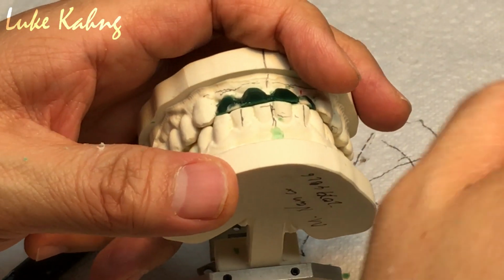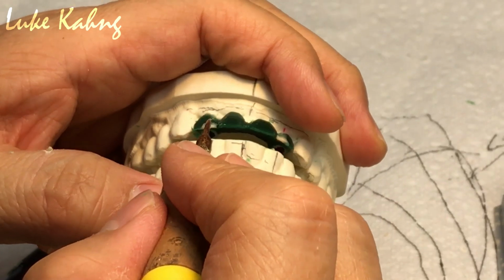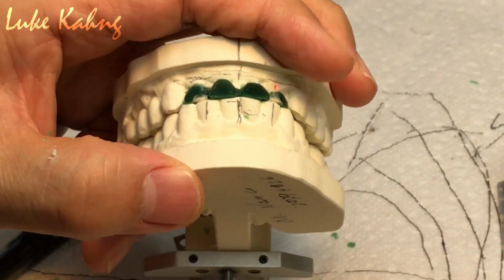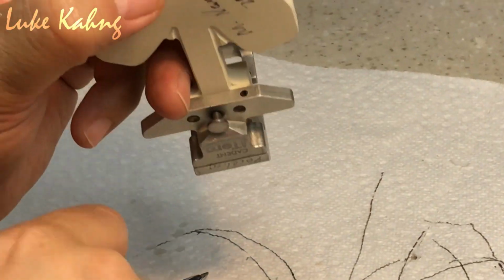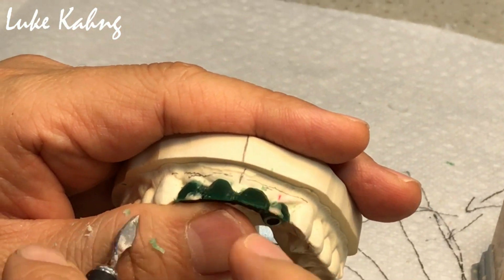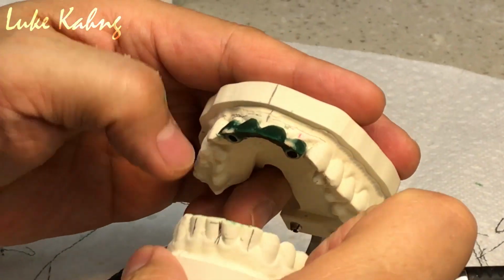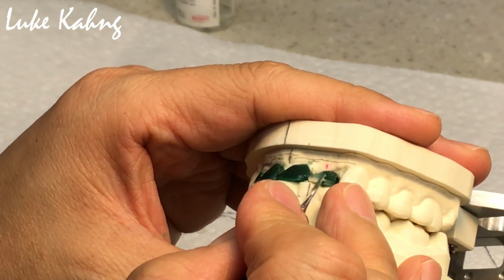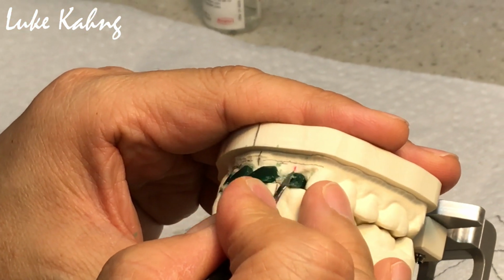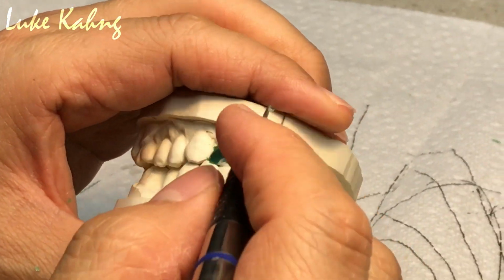Right, I'm going to add. Better, getting better. Yeah, that's what I need. Now. Open. Now it's good. So, okay, here horizontal facial view. I don't need thick here, but I need a certain thickness, then I'm okay. I don't need a super thin, I need a certain thickness here. That's good. Same thing here, this is pretty good.